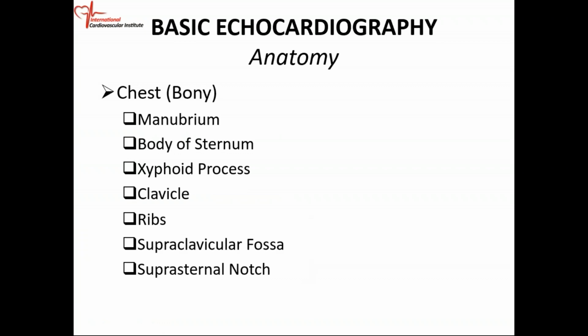All right, so let's look at the bony structure of the heart. I mean, the bony structure of the chest. And when we talk about positioning the transducer or the probe, it is in relation to the bony structures. So you have to know the bony structures fairly well.